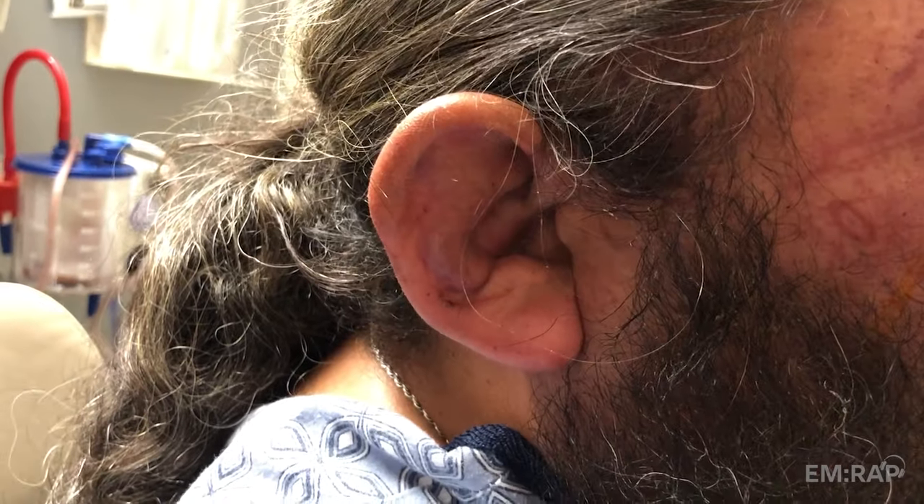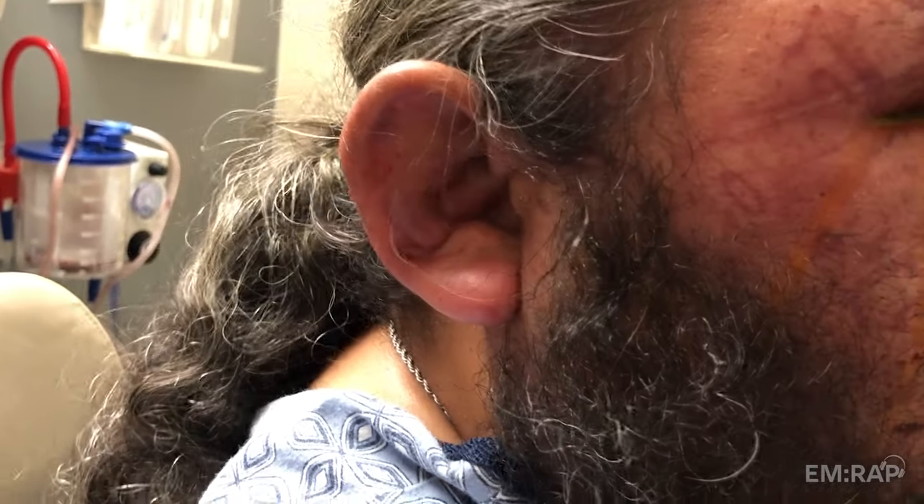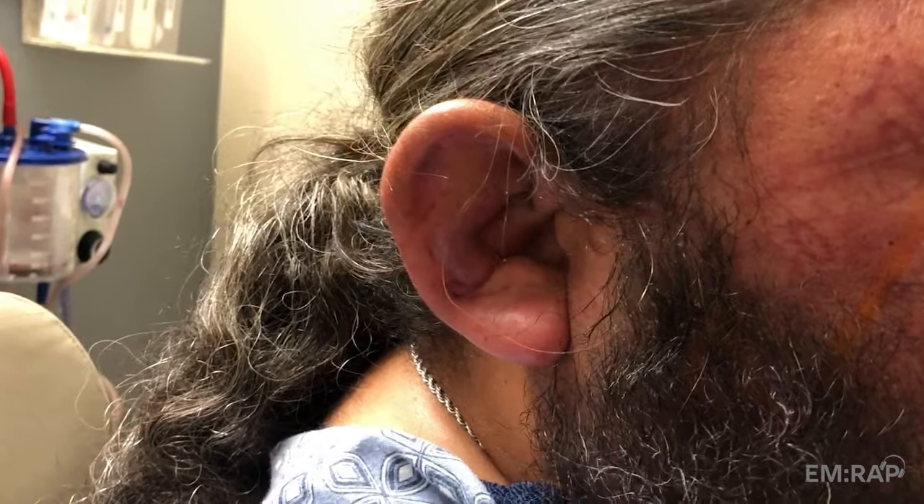This patient has an auricular hematoma. He needs an incision and drainage and a compression ear bolster dressing so he doesn't develop a cauliflower ear.